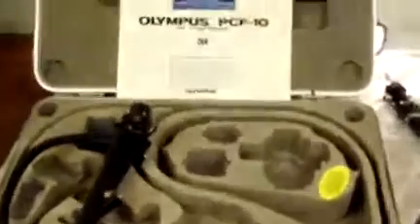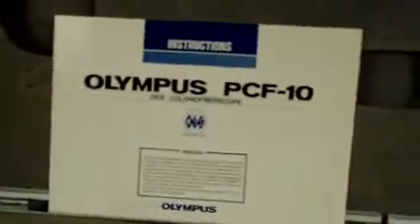Hey, it's Keith from DCSP Medical. Today we're looking at an Olympus PCF-10 Kalana Fibroscope.